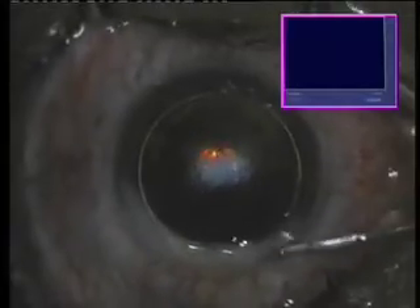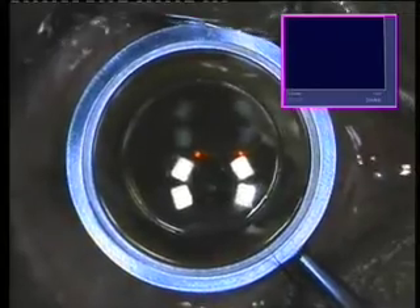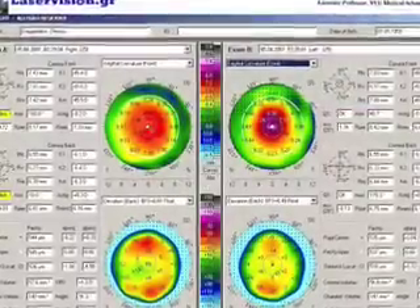The flap will now be placed into position in a fashion similar to the other eye, with copious irrigation, and fixation of the flap with the Johnston applicator to assure the absence of microstria. In a few seconds we will see a comparison of the postoperative topography of the right and left eye. You will be able to appreciate, by looking at the Pentacam images of the ablated corneas, how different these ablations are, and our reasoning behind advocating topography-guided treatments.